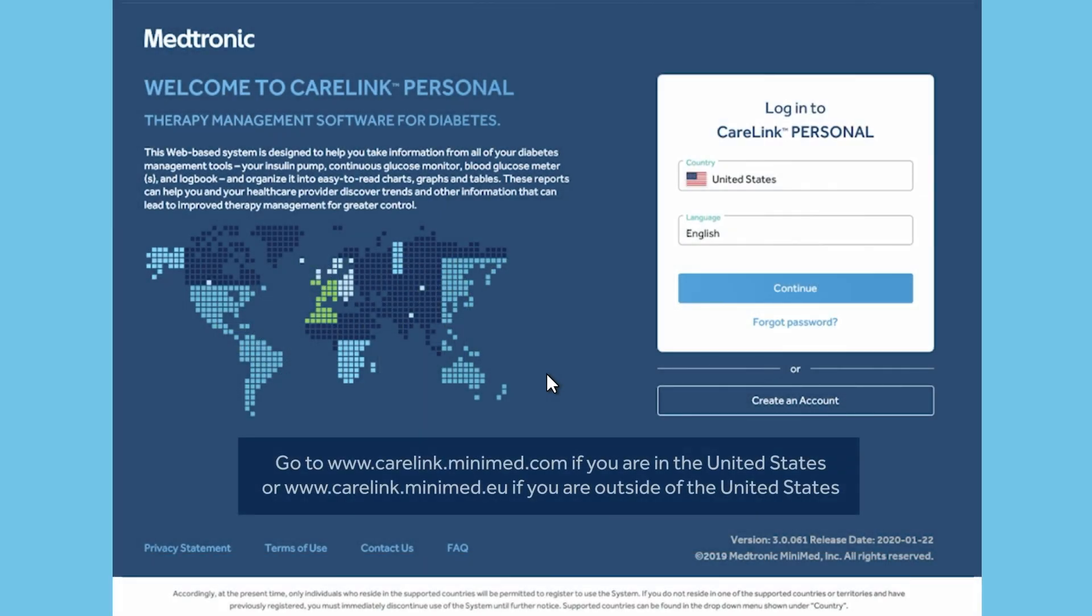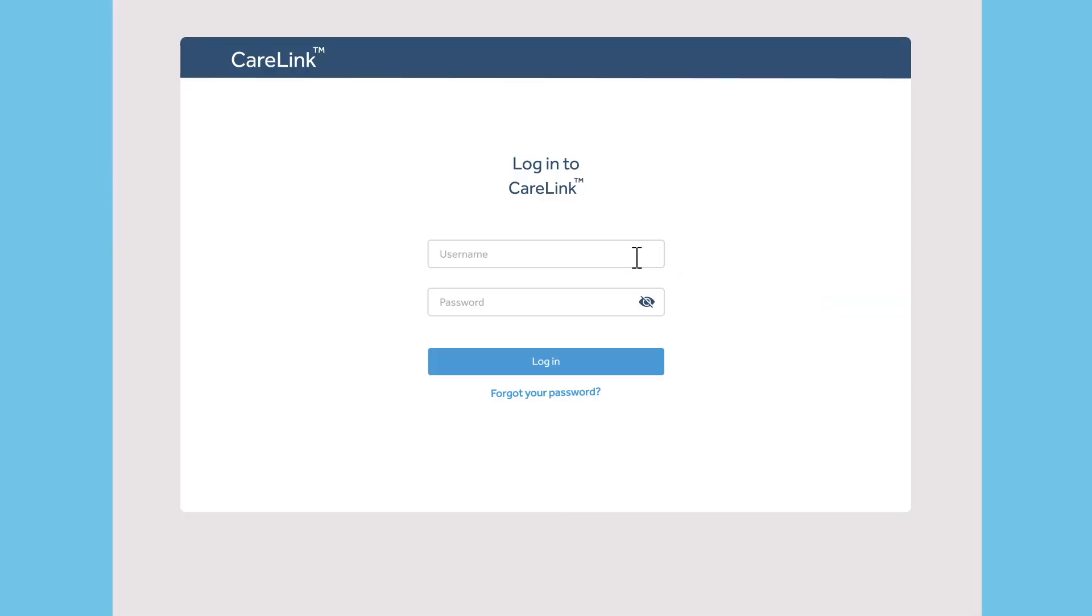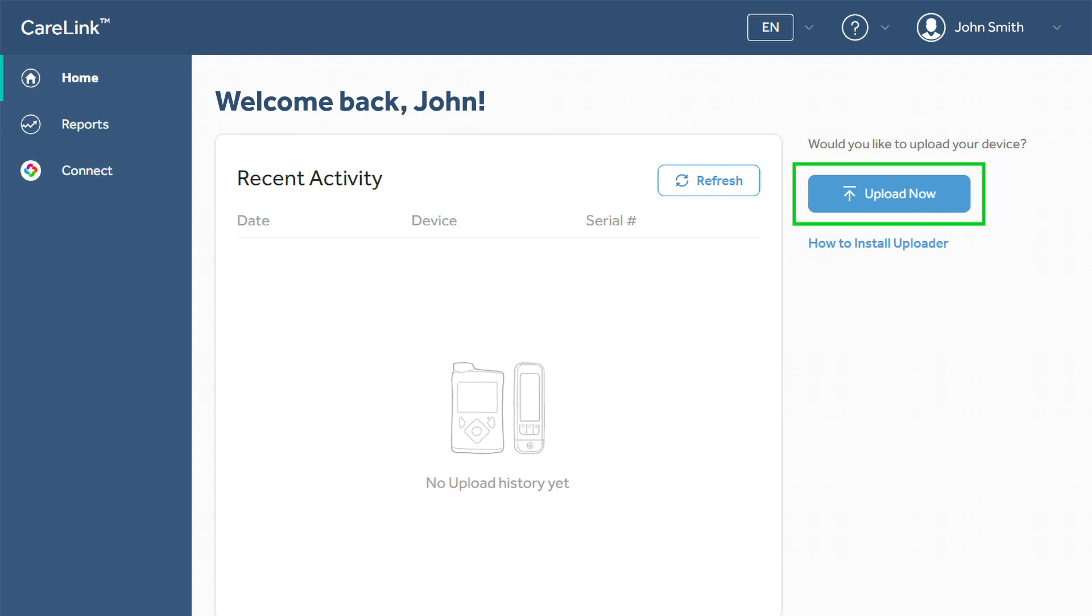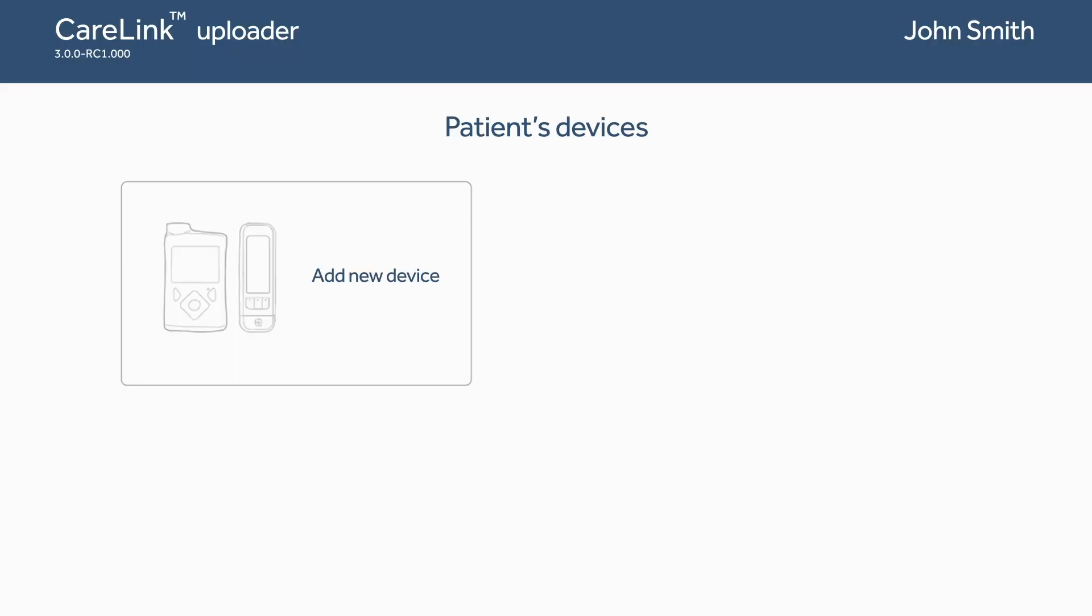Using a compatible browser on your computer, go to the CareLink personal website and log into your account. If you have not installed the uploader yet, click on How to Install Uploader or view the video instructions for installing the uploader. Make sure that pop-up windows are not blocked. Once installed, click on Upload Now and select Add New Device.